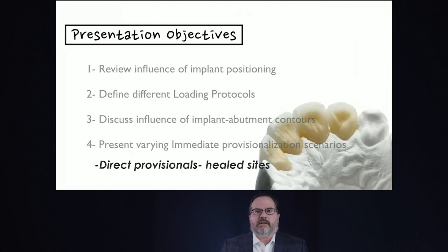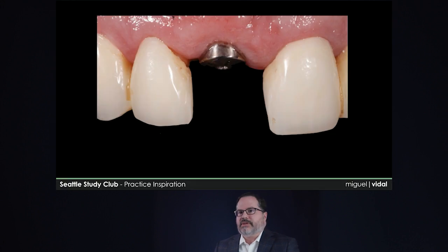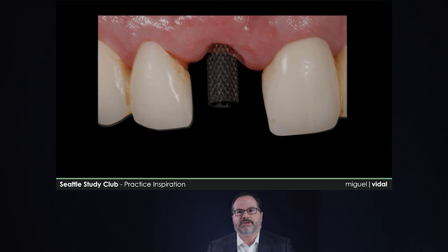So let's look at our patients that we're going to be doing direct provisionals in healed sites once the implant is placed. And here we have a patient with a healing abutment. The implant is just placed. We're going to go ahead and place our temporary abutment, as you see here.